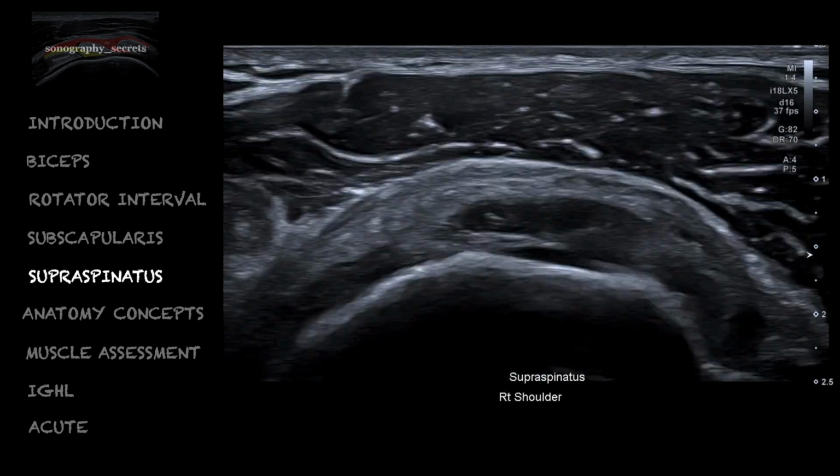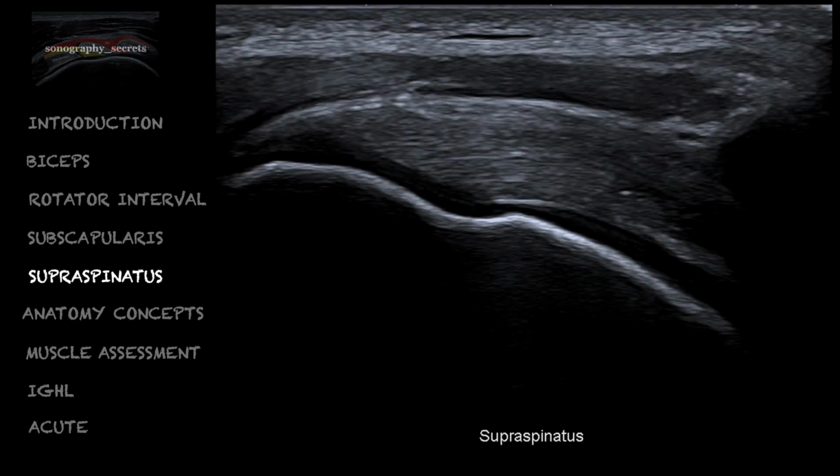Now, that term delamination is a term used frequently to describe tendon tears. Essentially, this is where the tendon fibers fail along its longitudinal axis. So in this example, this represents the delaminating aspect of this partial thickness articular surface tear.